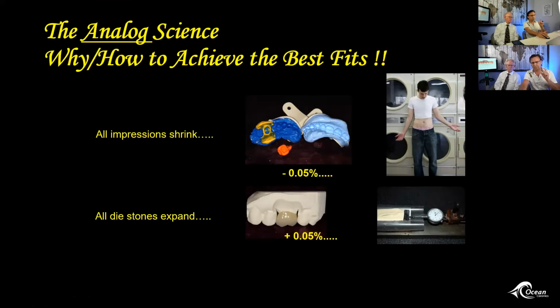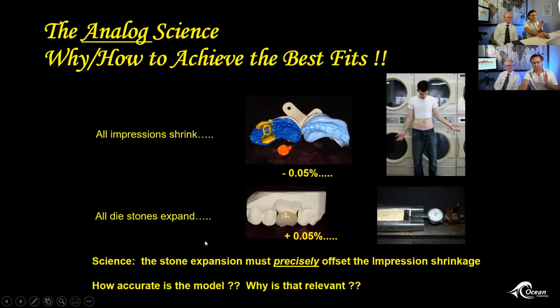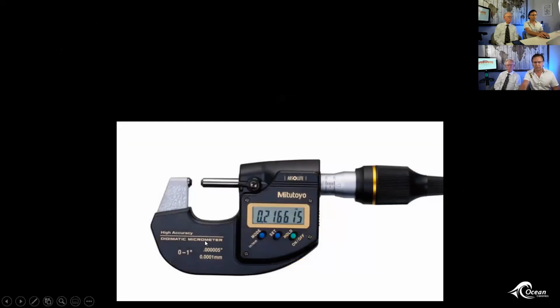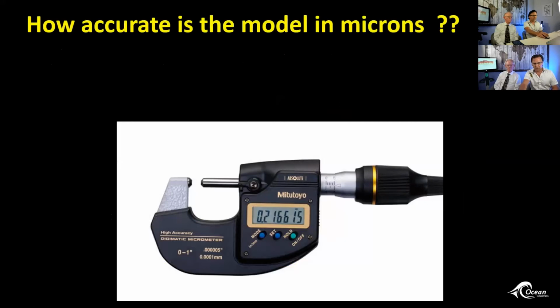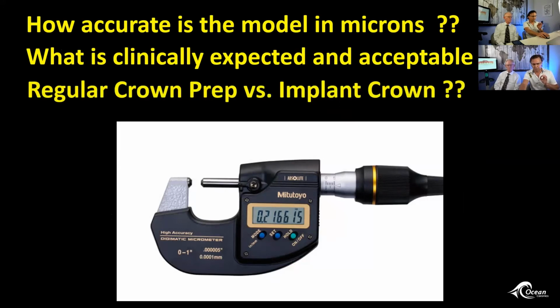And data is the best four-letter word in digital dentistry because you have to follow the data. So the science behind our success is the stone expansion must precisely offset the impression shrinkage. How accurate is that model? Why is it relevant? Because adjustments cost money, the old cliche. So how accurate is the model in microns? What is clinically expected and acceptable for a regular crown prep versus an implant crown?